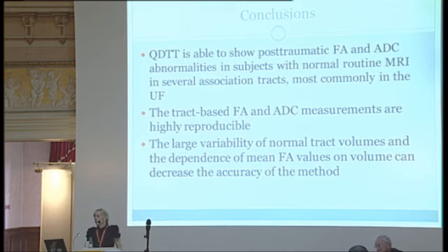The tract-based FA and ADC measurements, according to our study, are highly reproducible, but the large variability of normal tract volumes and the dependence of mean FA values on volume can decrease the accuracy of the method.